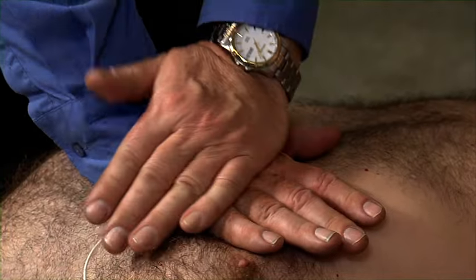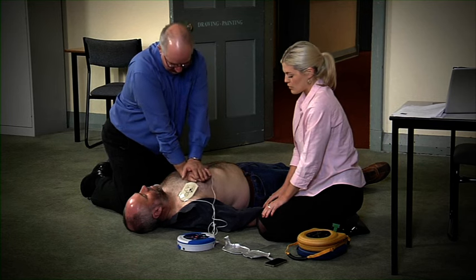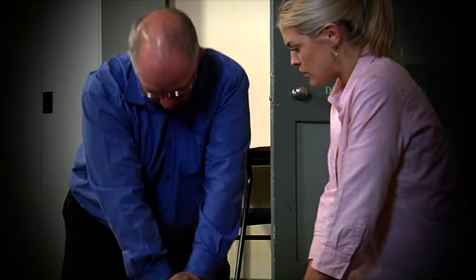Place overlapping hands in the middle of the chest. Press directly down on the chest in time with the metronome. When performing CPR, watch and listen to the AED. Push harder. It will analyse the effectiveness of the compressions.